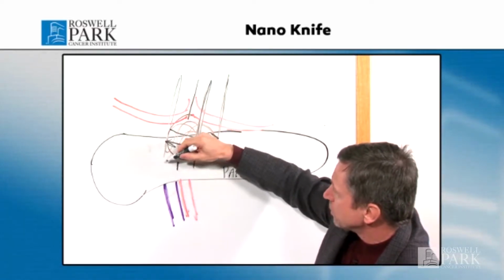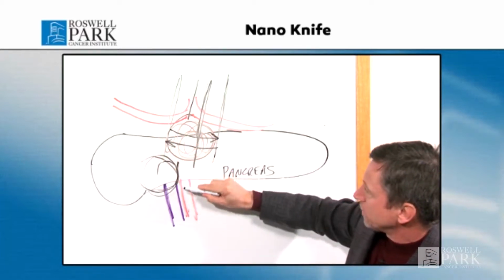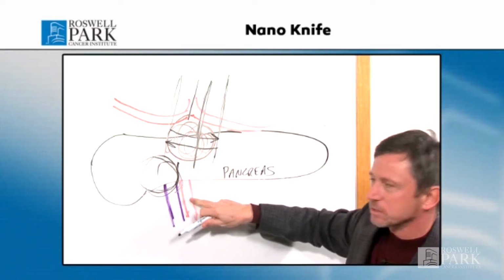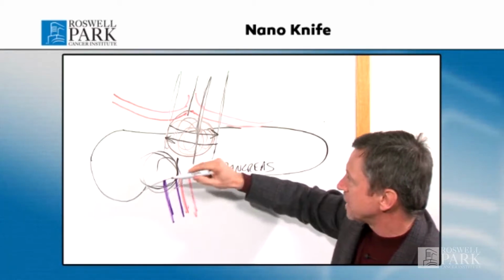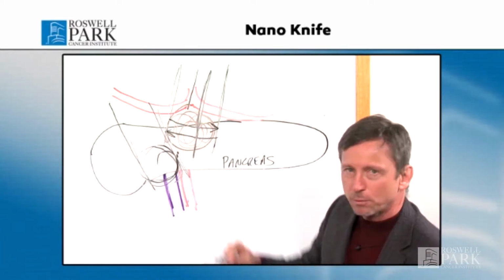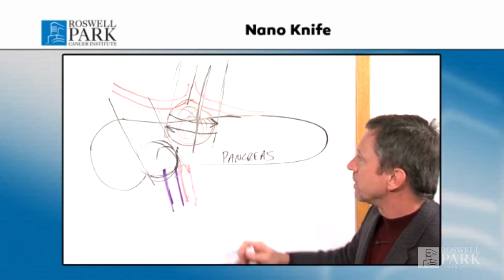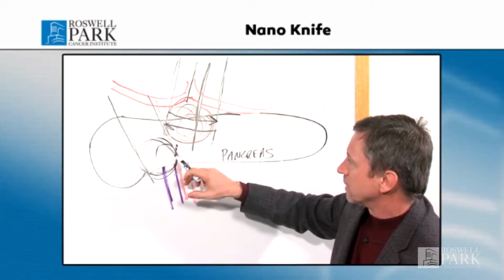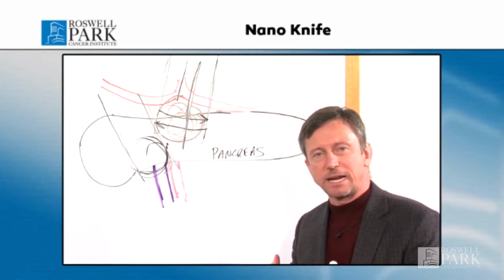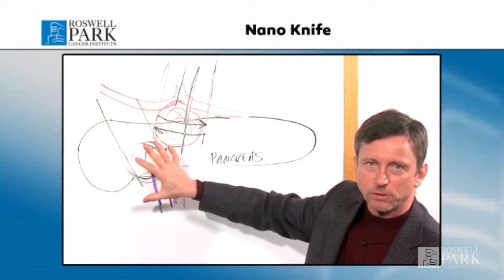There may be another situation where you have a tumor in this location that's involving or wrapping around this artery here. This is called the superior mesenteric artery, but the same concept could apply. You bracket the tumor with these probes, apply the electrical energy through the NanoKnife generator, and you can actually kill the tumor in place. Then we follow it with CT scans over the course of many months, and we should be able to see our treatment effects.